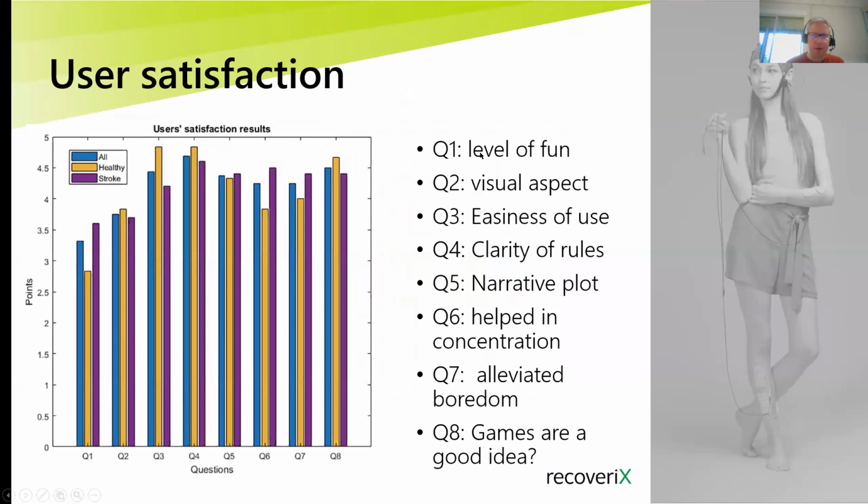So to summarize, using the games in your daily treatment, I would recommend for a new patient, you would start with the standard avatar, of course, doing some training sessions, feedback sessions, maybe 3-4 sessions, but then you could already switch, try one of the games, talk to the patient first, of course, what's his feeling about trying a game, and then if he's open to the idea, just give it a try, and then if the accuracy is good or similar as before, you can stick with the game for the rest of the rehabilitation.